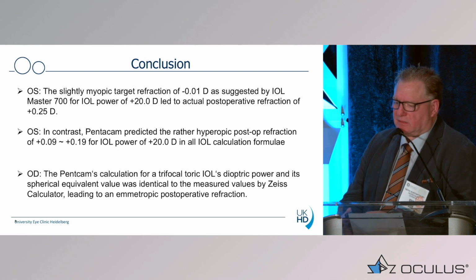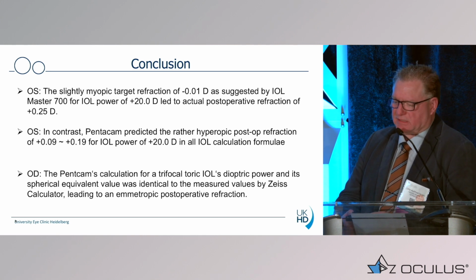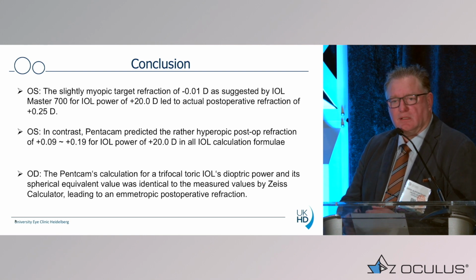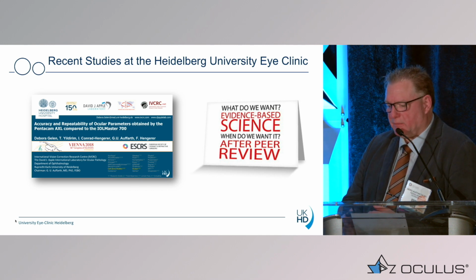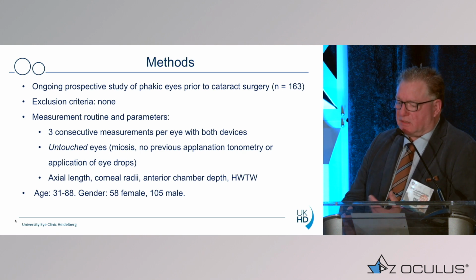We could see that the first eye, we would have better gone with the Pentacam AXL compared to the IOL Master 700. However, of course, we're complaining here on a very high level because we ended up nicely with both. So let's go and see how the Pentacam and the IOL Master 700 compares. We just recently presented some data at the ESCRS here. That's an ongoing prospective study.